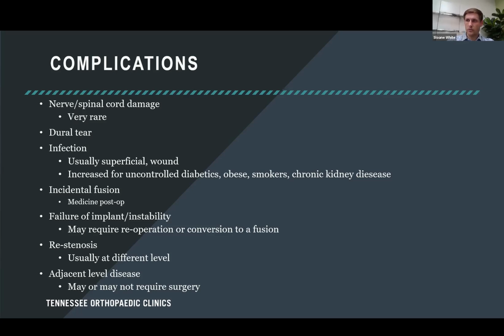While this is rare and there's very little research showing that this happens, there could be recurrence of stenosis from most likely arthritic changes. As the disc is removed, there shouldn't be another disc herniation causing any postoperative issues. And while there still is motion, it is not 100% normal natural motion. So there are still rates of degeneration of adjacent level disease, but as shown from long-term studies, this is significantly less than what has typically been seen with fusions.